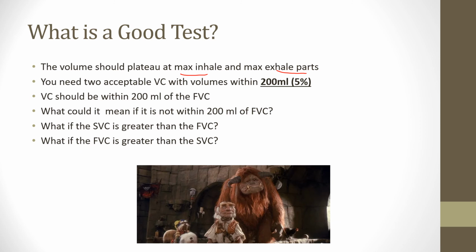If there's a peak and then a change of direction, then that means that there is no maximum inhale or maximum exhale where there's no plateau. So ideally, in a perfect situation, you would see that plateau, right? And that's the whole plan, is to see that plateau. That tells you that you got the maximum effort out of that patient. Sometimes they're scared, sometimes they're confused, and that's okay. We just need to do that test again, right?